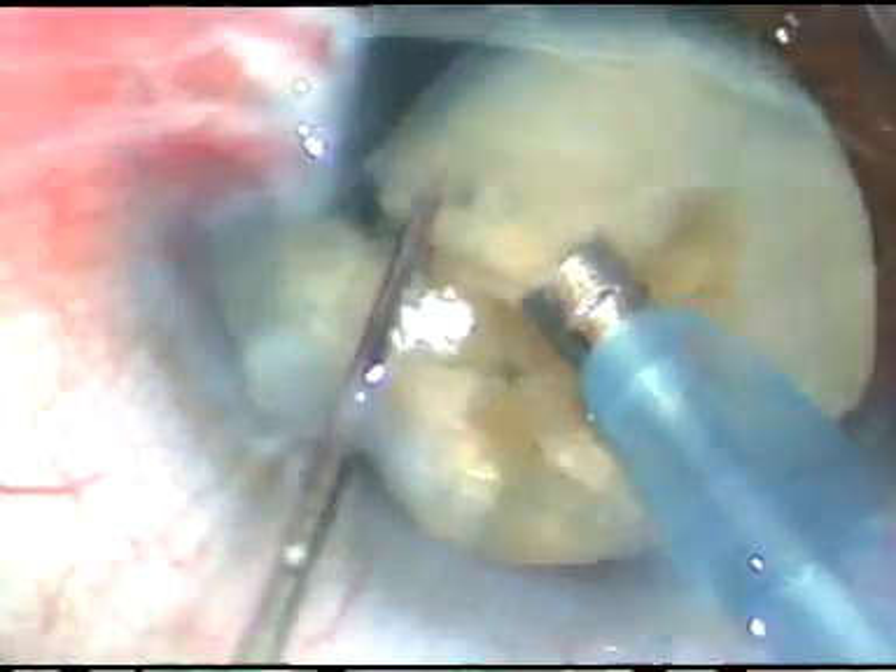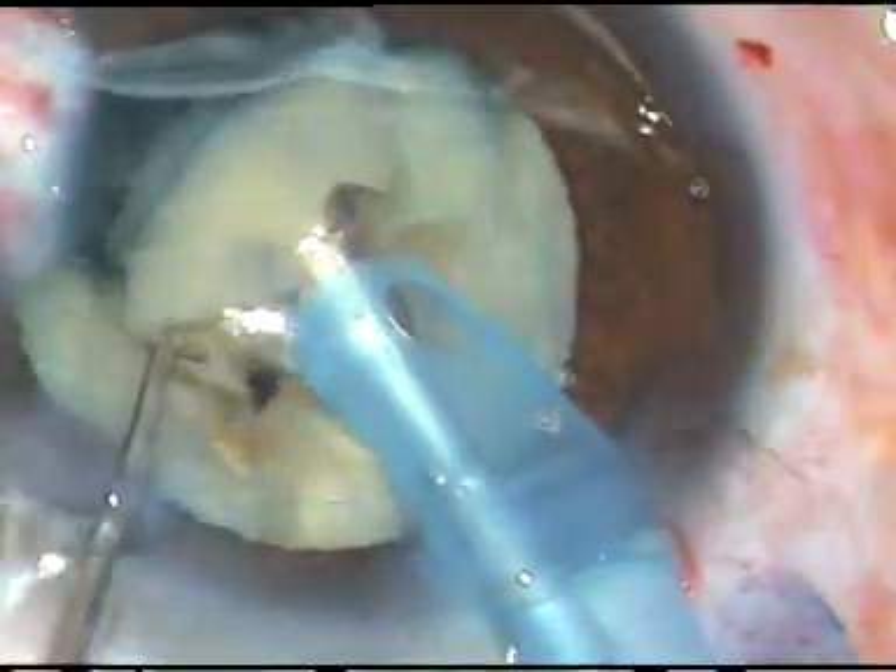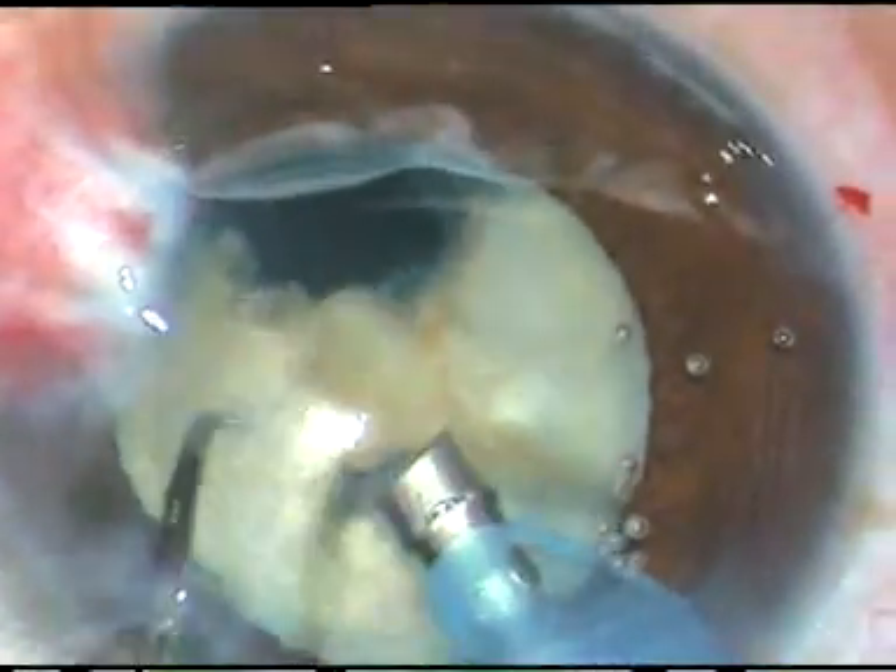This nucleus is a little harder, but it has been chopped nicely. And the nuclear fragments are being emulsified.